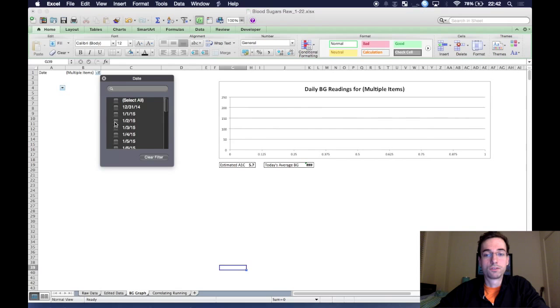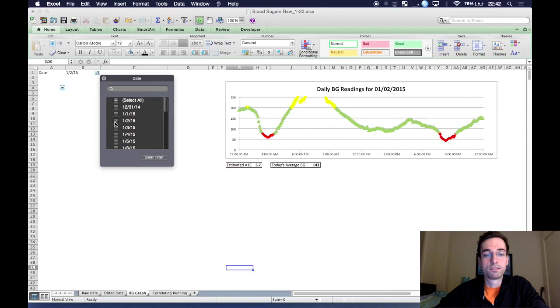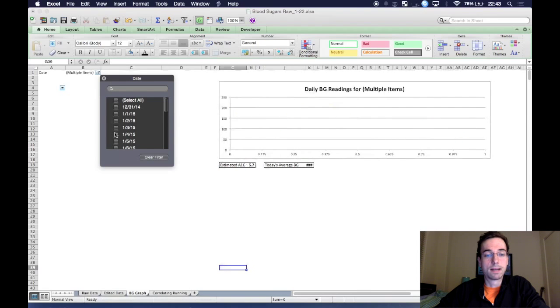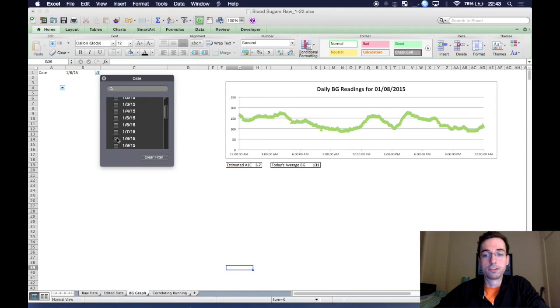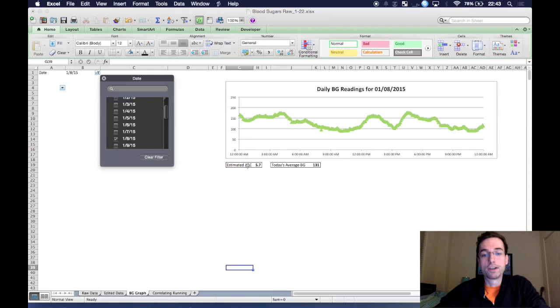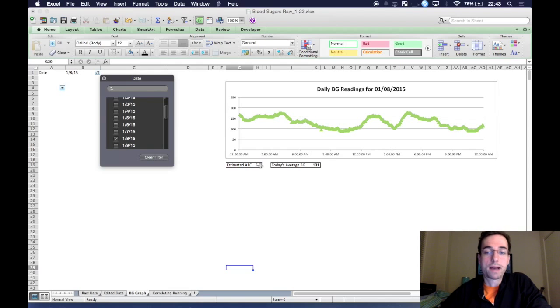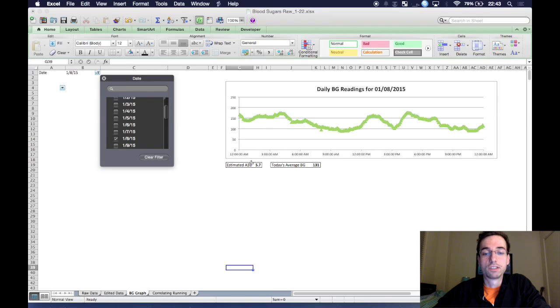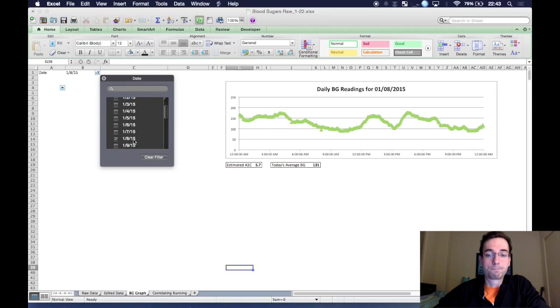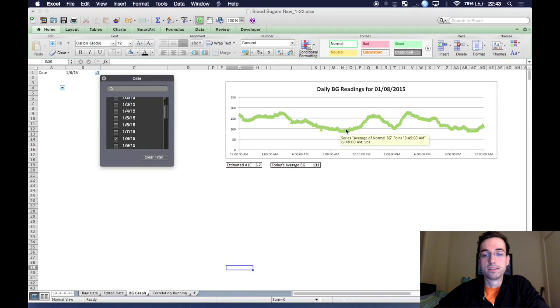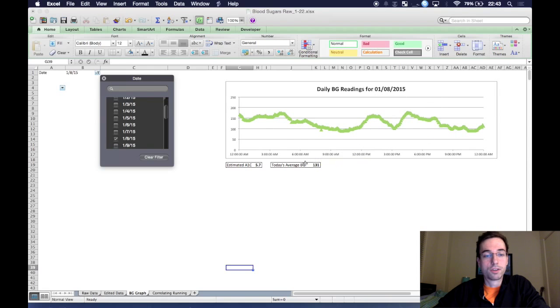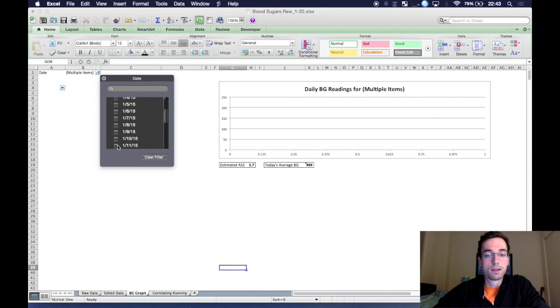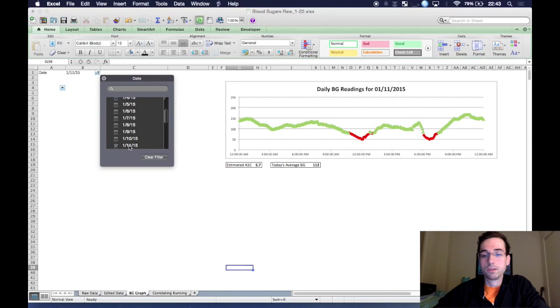And you can see, you can just sort of check off the different days and it'll show you your blood sugar. And in addition, I added a little couple boxes here for your estimated A1C over the past 90 days of readings, if you want. For me, I don't have 90 days of readings, so this is just over the past three weeks or four weeks, as well as an average blood sugar of this day. So you can see on January 8th, it was 131. And then if I go to, let's say, January 11th, it was 112.